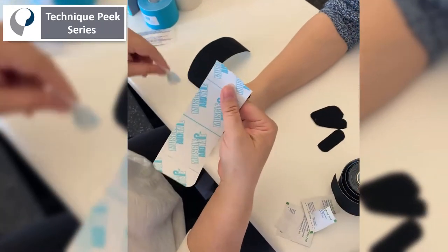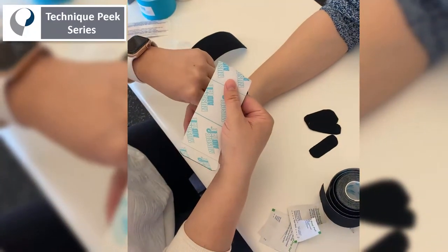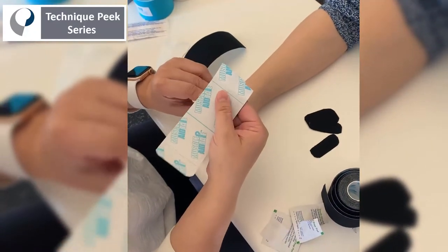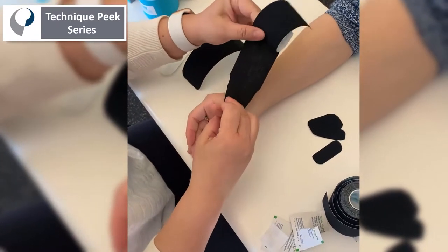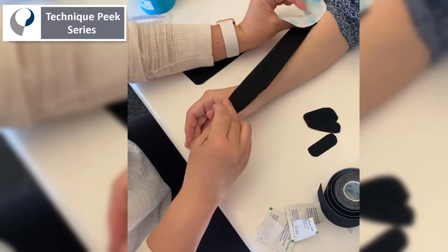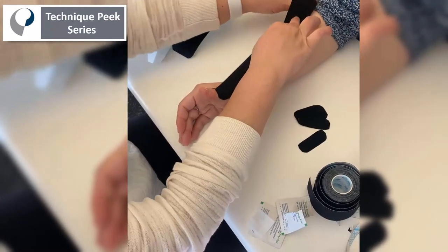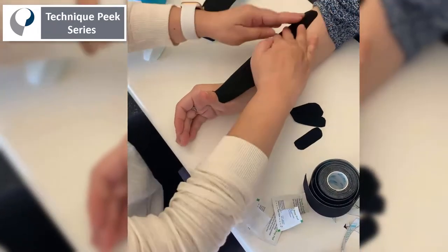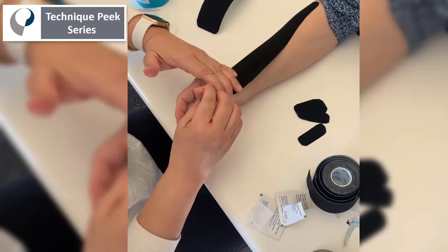Pull the tape apart and anchor it at the thumb. Tell the patient to extend the thumb as far as they can. Try to avoid touching the tape in any way, and pull the tape out over the thumb extensor group, then lay the tape down flat.